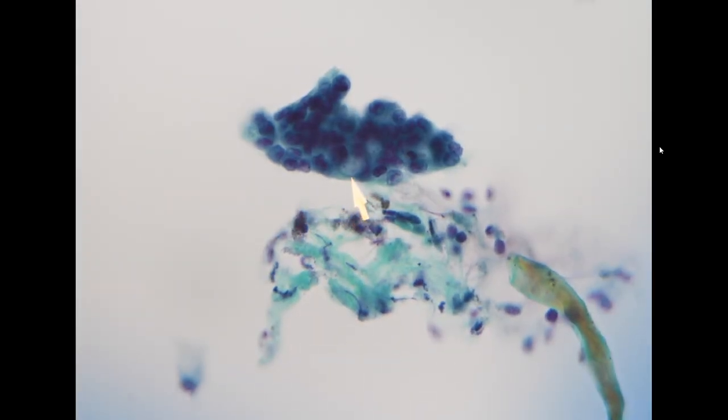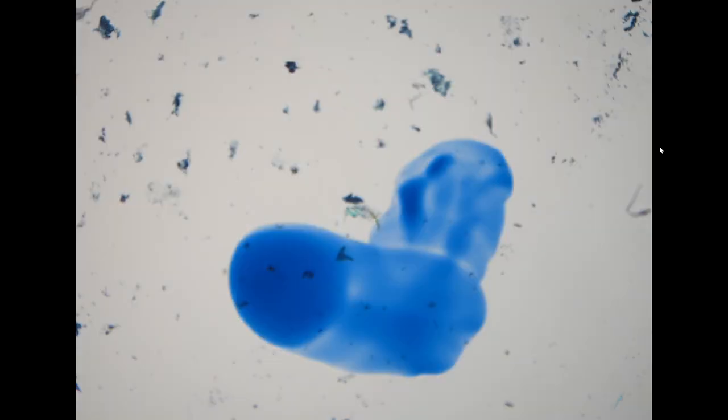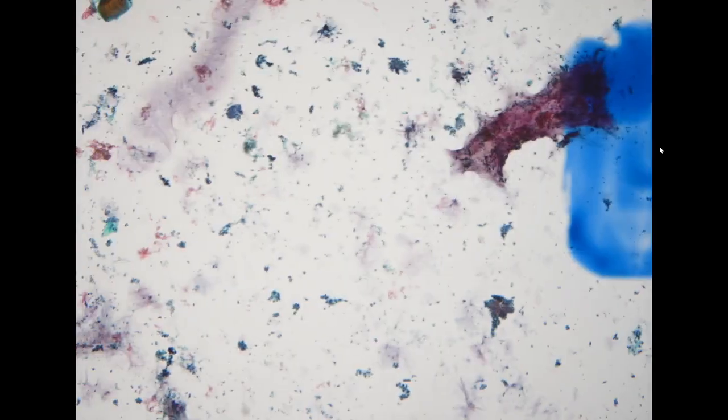You can see there are a couple of abrupt mucin differentiations with vacuolated cytoplasm over here. So this is positive for adenocarcinoma, and the contrast is very obvious compared to the adjacent normal mucosa.